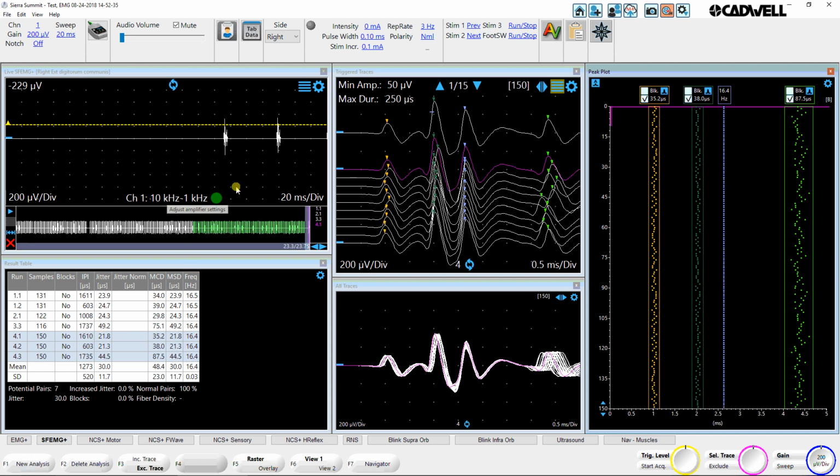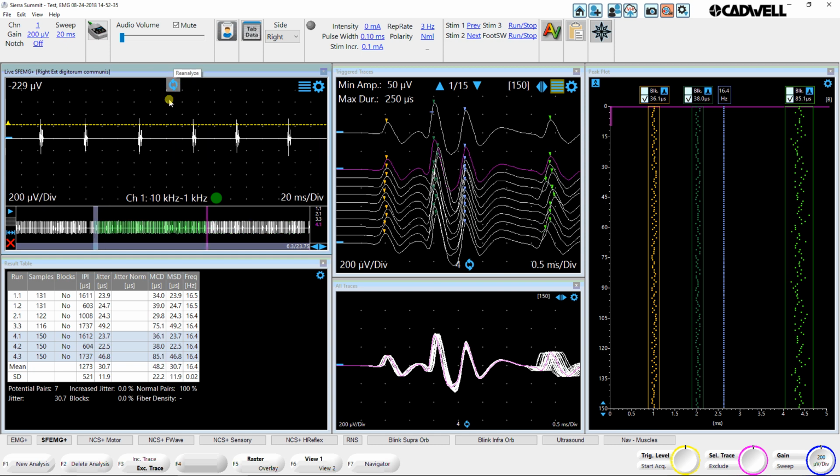And again, here's our live window. You can see here in the buffer that we are analyzing this portion of the buffer. If I actually saw something back here that I liked, I could either keep this and start a new analysis, or I can just come back. Maybe I wanted to analyze from here, so I'm going to drag back to here and reanalyze, or just readjust the buffer. And now I have the analysis of this portion of the buffer, which was starting where I started, and then 150 sample points, because that's what I have this window set to here.